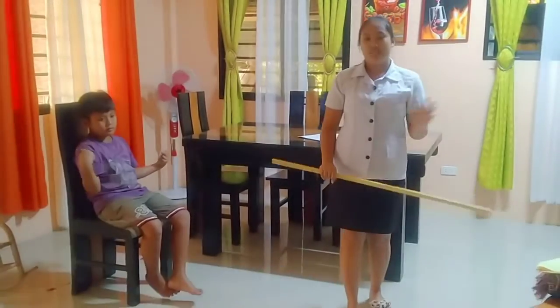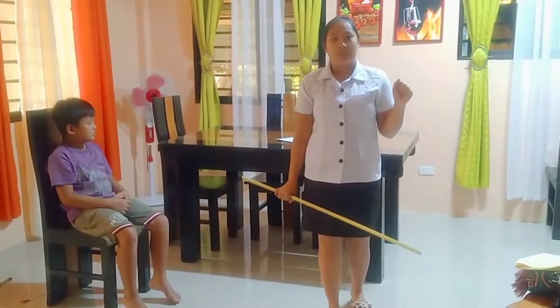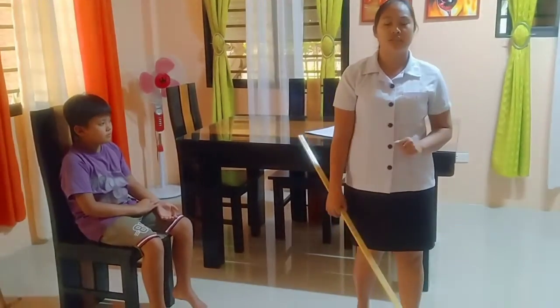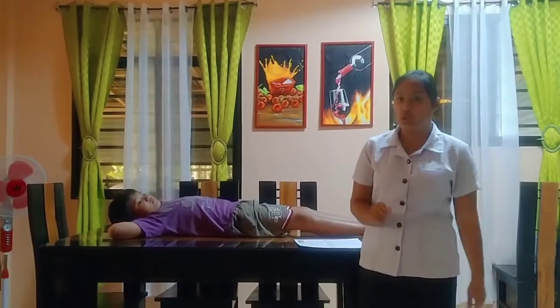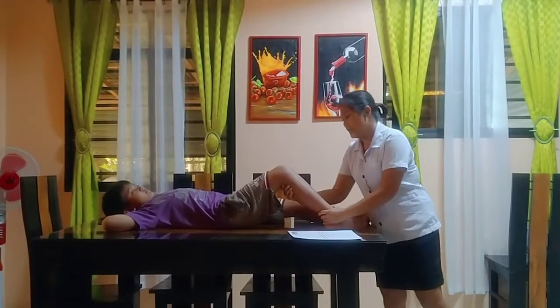So, this projection shows a very good demonstration of the femoral condyles and the intercondylar fossa. Next projection will be the Beclere method. So, kailangan po naka-flex ang knee ng patient 60 degrees only. Ganyan.